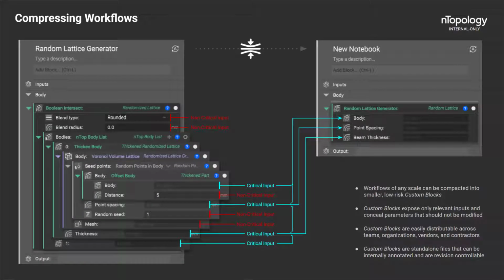For those of you not too familiar with custom blocks, a good way to think about them is to consider them as compartmentalized and compact versions of a set of blocks. Custom blocks have a variety of functionalities, but one of their most common uses is to take a handful of complex or non-intuitive blocks and combine them in such a way so that all the complexity is hidden and only what is important becomes available to the user. The biggest benefit this provides is the ability to take a really long or complicated workflow that would normally use a lot of blocks and condense it down to just one or two.